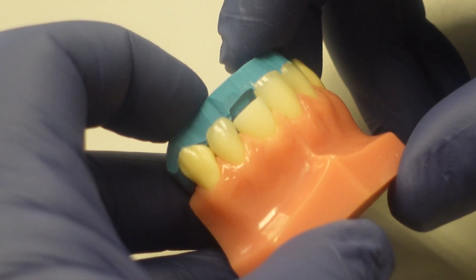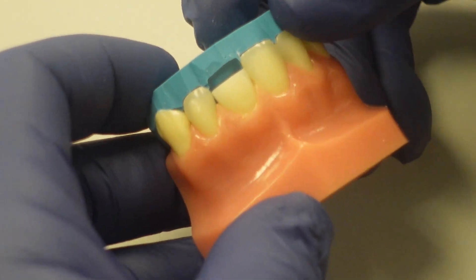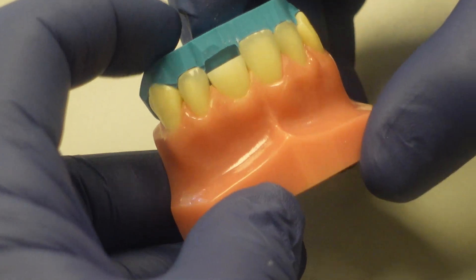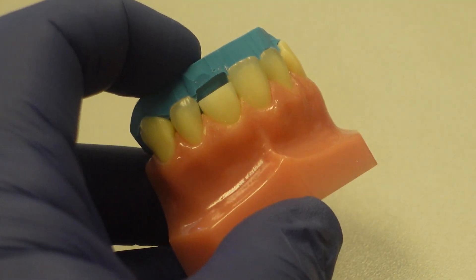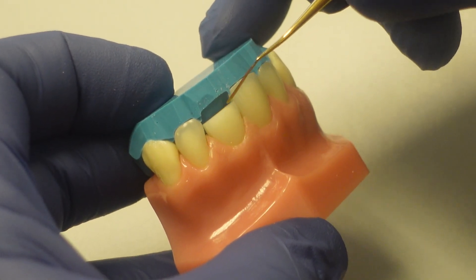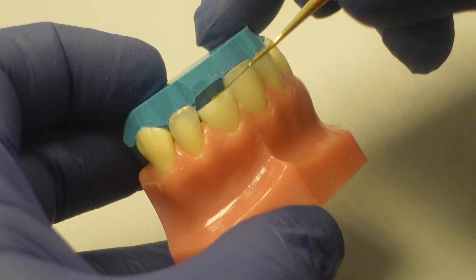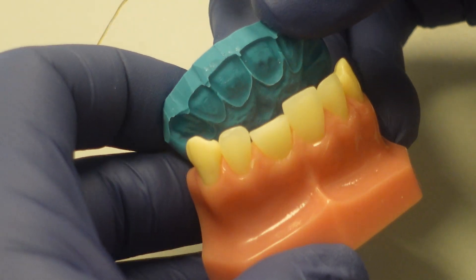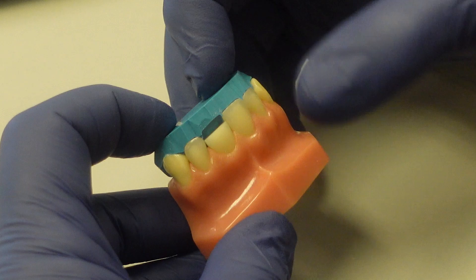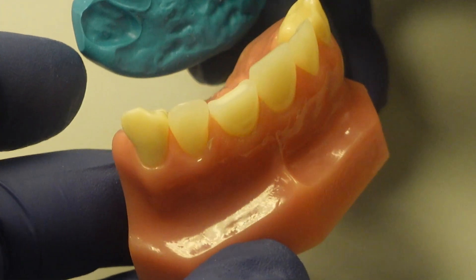Usually that's done on the model or the wax-up. And then we're trying this back in the mouth before I load the template. Sometimes what I'll do is actually score the lingual of the template just a little bit with a light mark, so I can tell where that lingual margin is. You can see that little line I just created. So once we've tried in the template and I've scored the lingual, I know how much to load — I'll show you how to load the template.